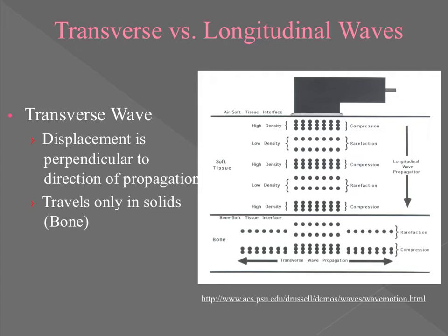If that ultrasound head stays on the tibia, it's going to create transverse waves, and that is going to do what to our treatment? It's going to reduce our treatment effect. So we have to make sure we're staying closer to the tibialis posterior, right? And further away from the medial tibia.